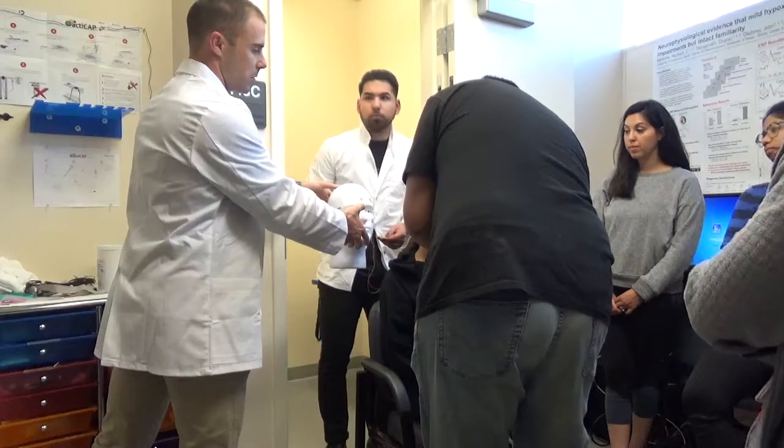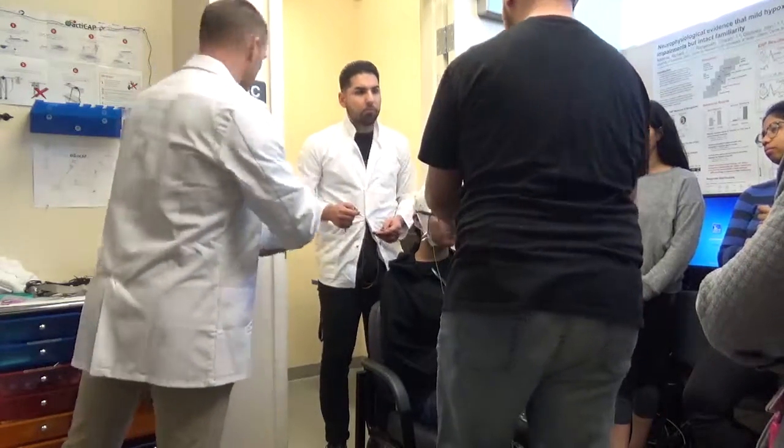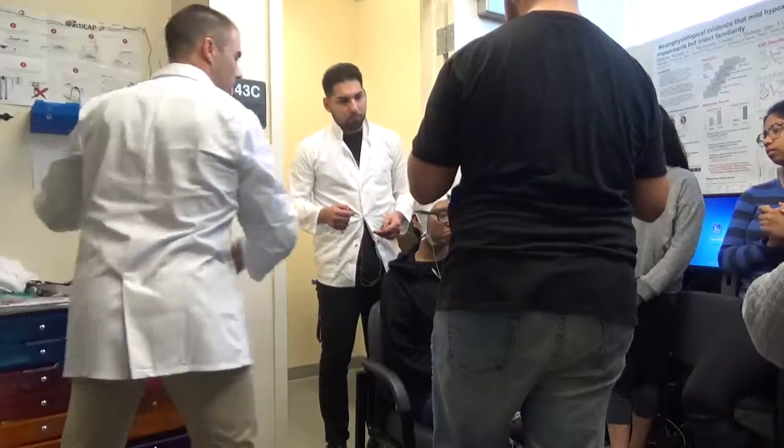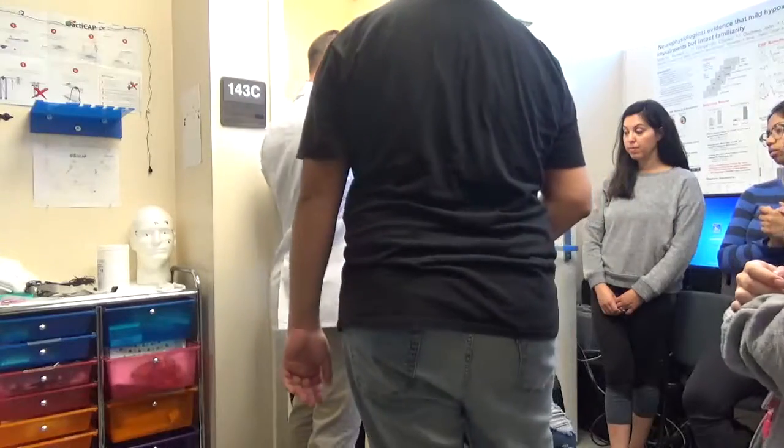Does the ground electrode need gel? Or did you guys put it in? I think you put it in already, right? Yeah. And then you can feed that wire a little bit in the back here. And so we can kind of bring this back there.